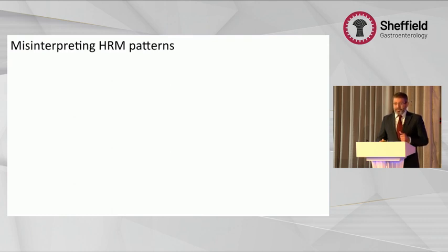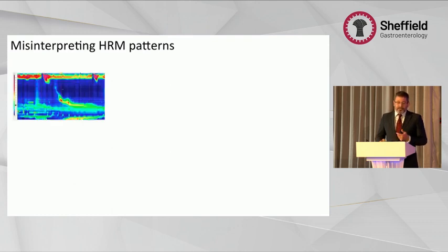Manometry is all about pattern recognition. So it's very important for one to look and see and interpret and look at other reports and just familiarize with patterns. So here's an example of a report. What you can see here is something very interesting. If you look at the bottom, there's 2 mirror images at the bottom of this manometry report. This is called a butterfly effect. So the lower esophageal sphincter is replicated twice. And that's because the catheter has curled.